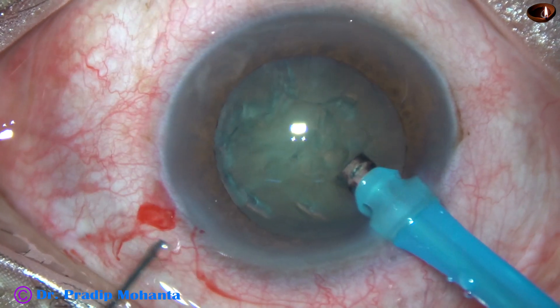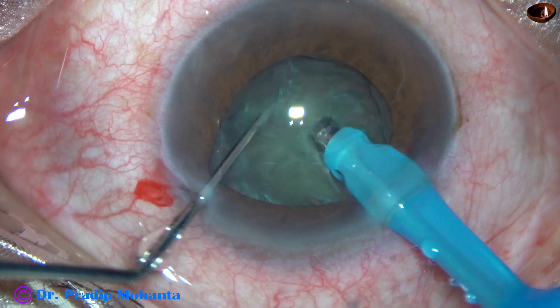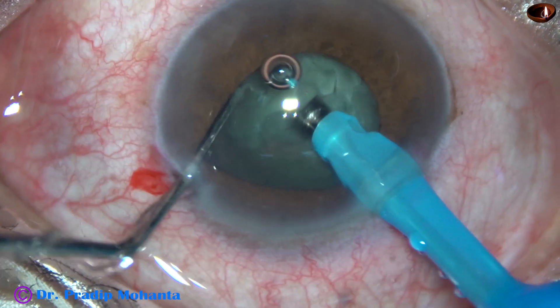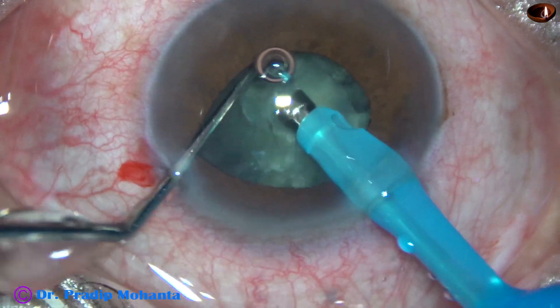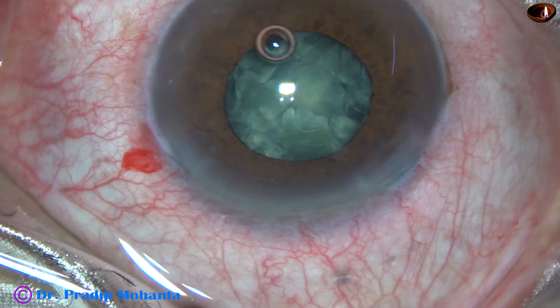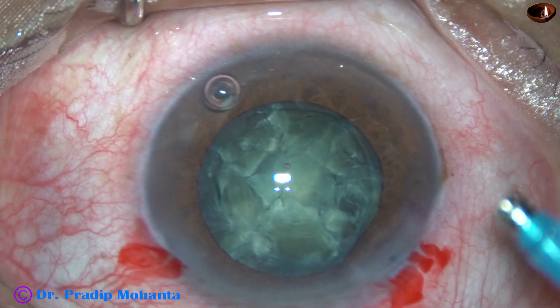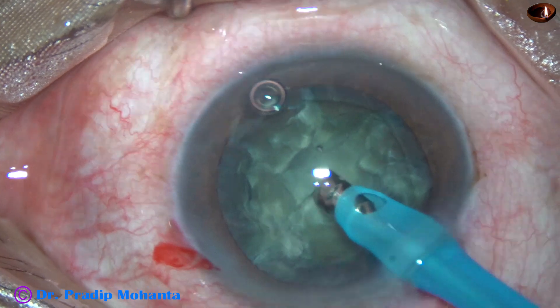My plan is to chop this nucleus. As I start chopping, the pupil becomes small and the iris tends to get incarcerated in the sideport — there is some floppiness of the iris. I have decided to chop this nucleus and then come out, removing the handpiece first and then the chopper, to avoid injury to the iris. Now I am going to do single-handed PHACO, meaning I am not going to use the chopper to manage the nuclear pieces.